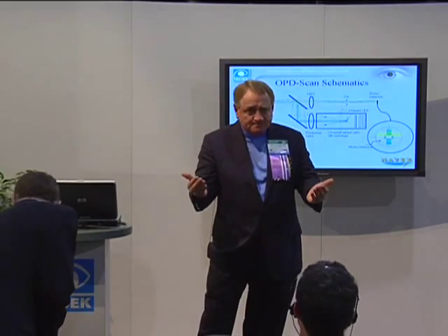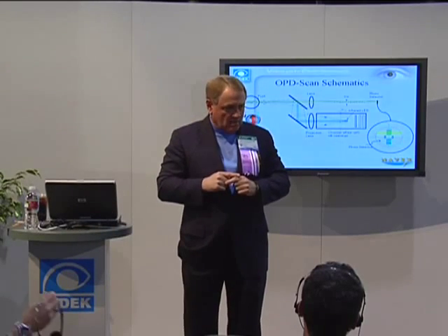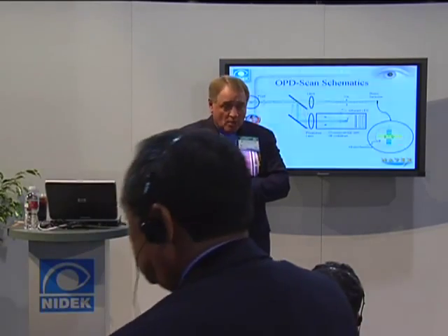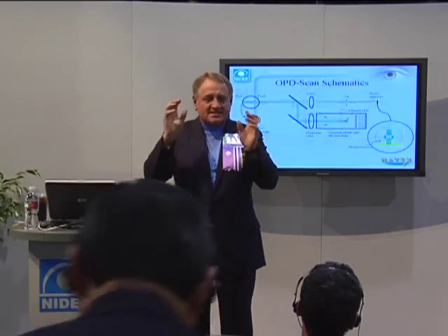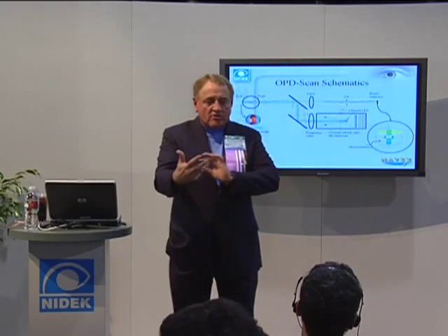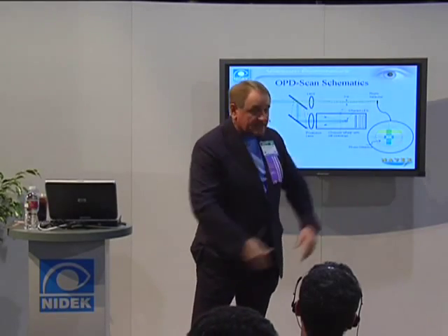Spatial refractor. So unlike a Hartmann-Shack or a Tscherning, this thing starts out with refractive error. It doesn't have to measure the spacing to figure out anything. It's just like your retinoscope. So the autorefractor and the refractive measurements that we get are good, and it's from that data that it calculates the Zernikes, the Fourier, and all those things that we talk about, but the Hartmann-Shack goes the other way. It has to calculate the Zernikes and all that stuff, and finally downstream you can calculate a refraction.